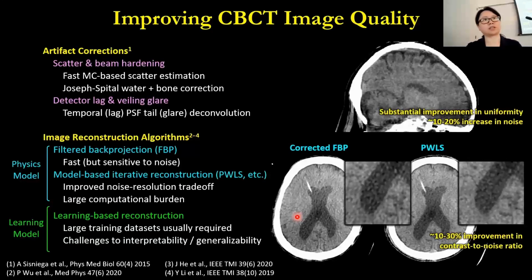And therefore, in this work, we want to present a DL-Recon method, which reduces biases and noise, and at the same time incorporates the physics model based on the uncertainty information to promote the method generalizability and robustness, and also to offer data fidelity.